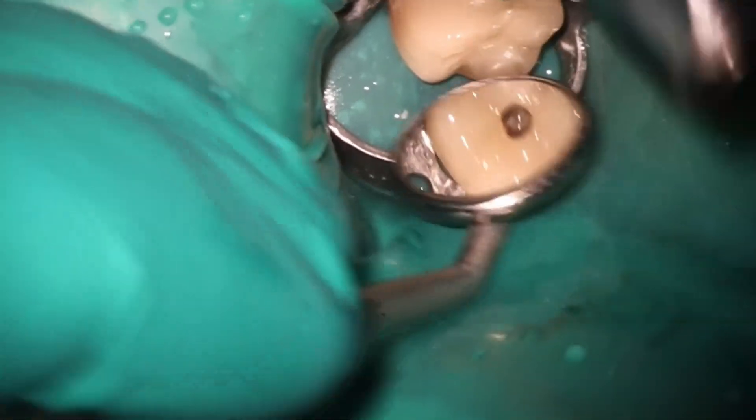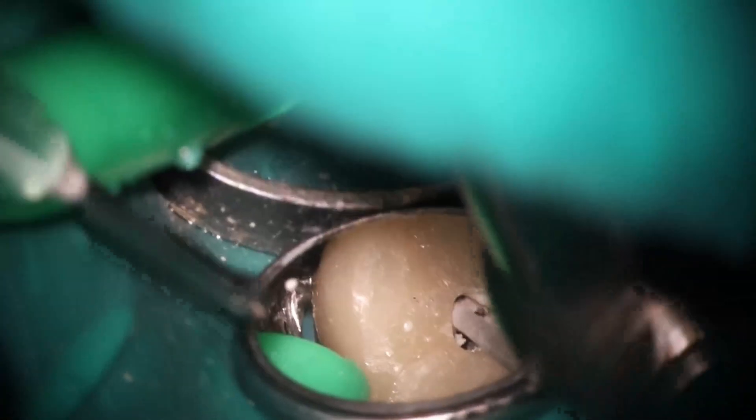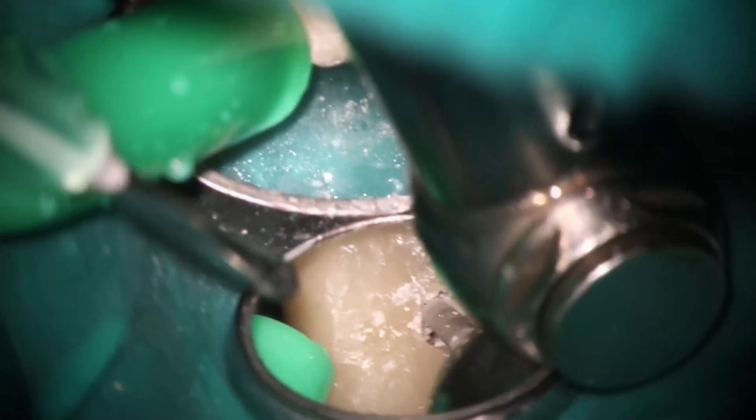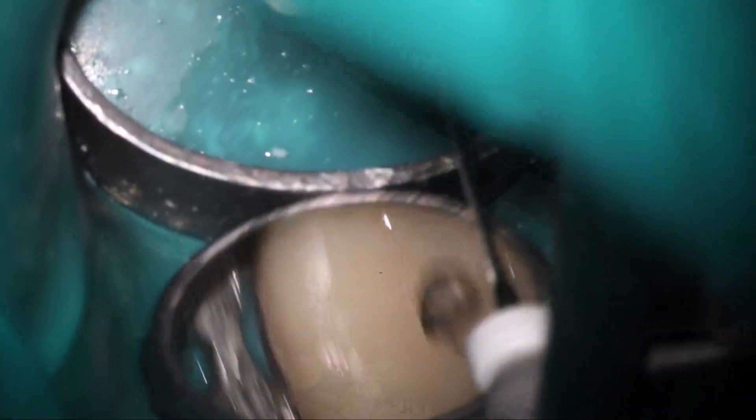Sorry, this angle isn't great. Sometimes when you're working through these really small accesses, I can see more than a camera can, because when you look through a microscope what you see is actually a circle, and I can see stuff on the edge of it. Sometimes I forget when I'm recording that I need to reposition, so sorry that you can't really see as much as you would normally.